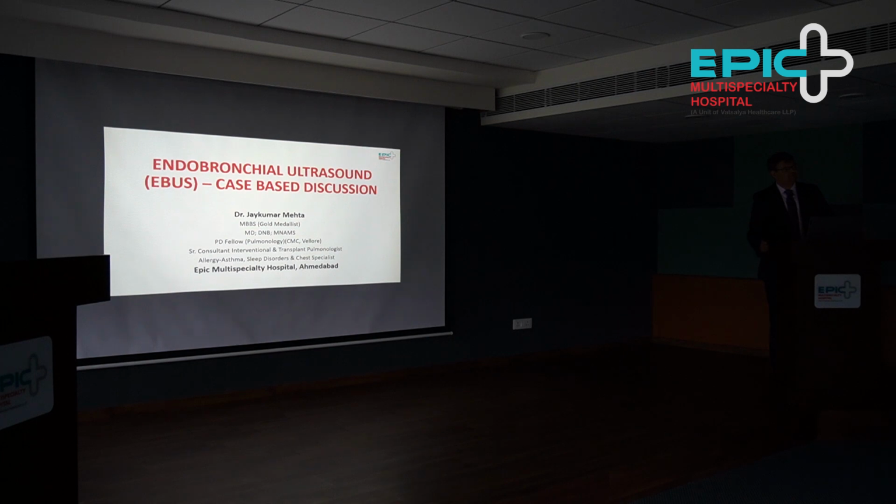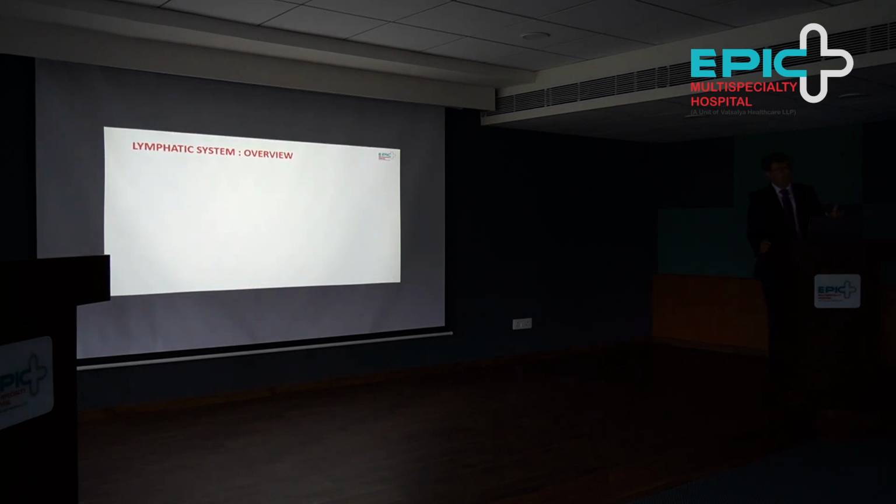What actually EBUS, or endobronchial ultrasound, is, I can say in only one line: it is an epitome of innovation in interventional pulmonology. But before this instrument was invented, what was the need? Why is EBUS the need of the hour in interventional pulmonology? Basically, it samples the lymph node.